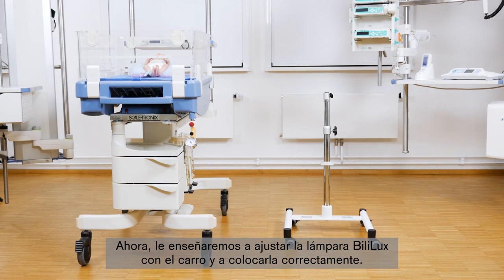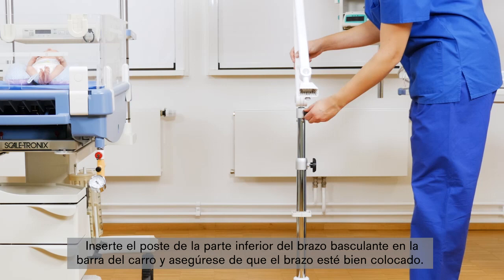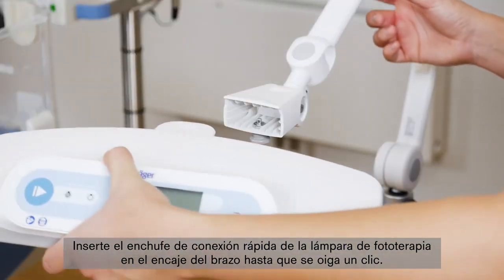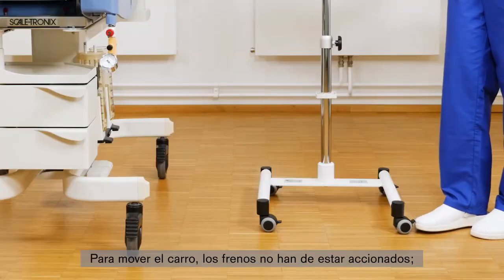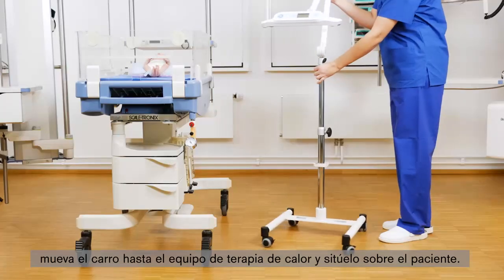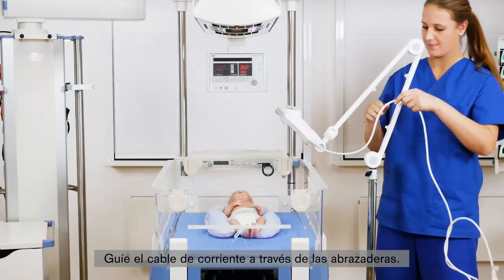Now we will demonstrate how to adjust the Bililux with the trolley and how to position it correctly. Insert the post on the bottom of the spring arm into the trolley pole and ensure that the arm is seated properly. Then tighten the tightening knob on the trolley to secure the arm. Insert the quick connect plug on the phototherapy light into the arm socket until it audibly clicks into place. To move the trolley, the brakes have to be released. Move the trolley to the warming device and position it above the patient. Guide the power cord cable through the cable clips.